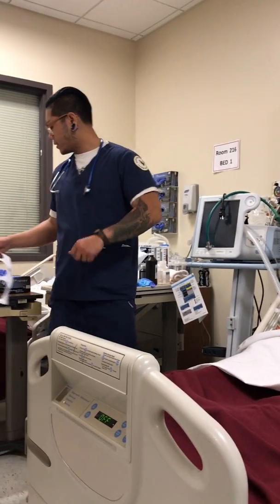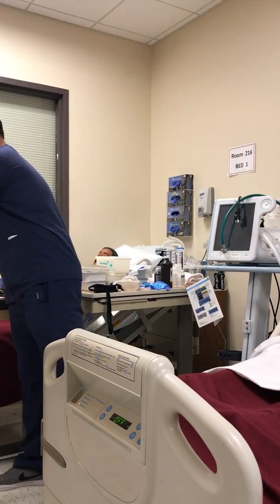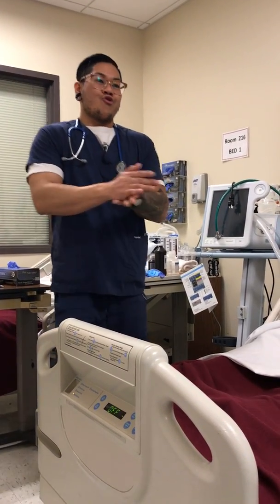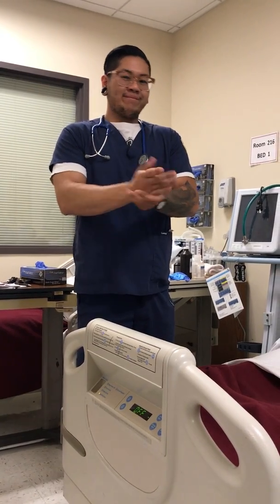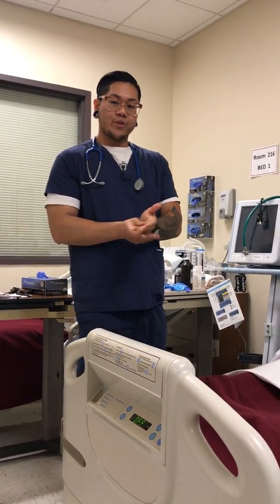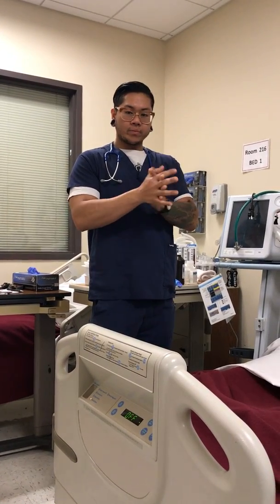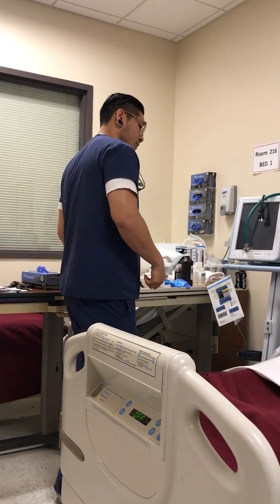Okay, so at this moment, I've got my stuff. I'm going to wash my hands and put some gloves on. And then don't forget to check the patient's charts and orders. Okay, so knock, and we're going to go in.